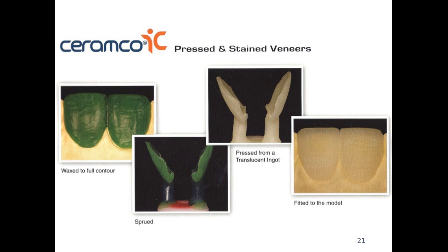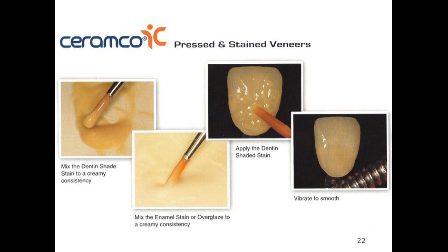Another method is to use pressing. With pressing, we have our model done in die stone, do a full contour wax up, sprue it, invest it, and then press it. After pressing, we divest and retrieve the veneers from the ring, cut the sprue, refinish, adjust contours or contacts if necessary, and then apply stain and glaze.